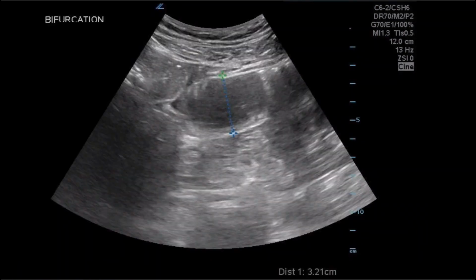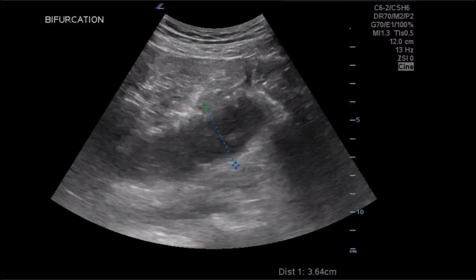To help with the diagnosis, the size of the dilated loops were measured and compared to 2.5 centimeters, which is commonly cited as the upper limit of normal. Multiple bowel loops were found to be dilated, and multiple loops showed the abnormal back and forth peristalsis. Given the classic symptoms, there was a clear diagnosis of SBO, yet this patient had no history of previous obstruction or previous surgeries of the abdomen. A CT was ordered with an indication of SBO found on ultrasound to evaluate for potential etiology of the obstruction.